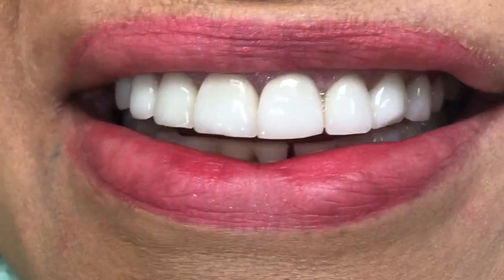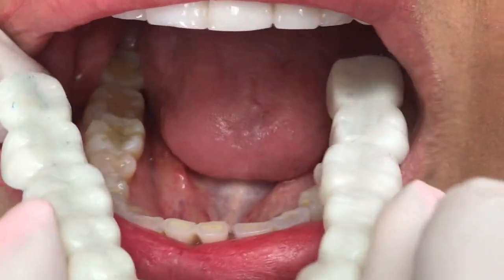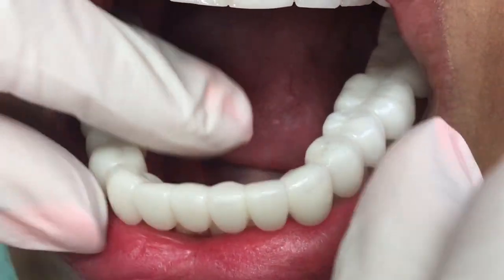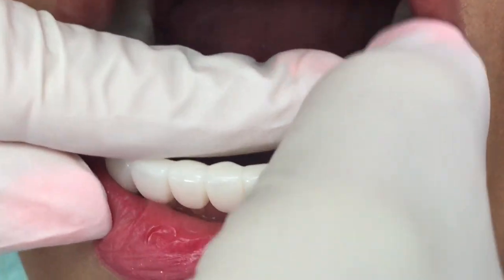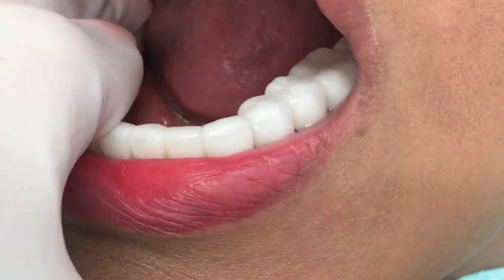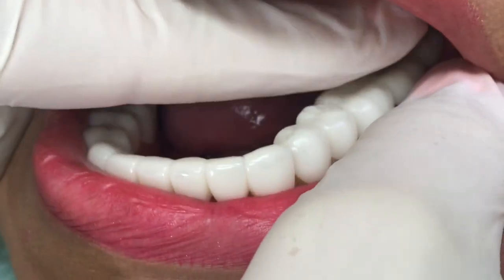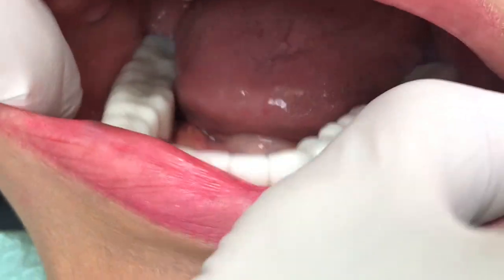All right, we're going to go ahead and place this in. So go ahead and open. Now she hasn't seen it. The appliance literally is held by retention. There's no glues, there's no adhesives, there's nothing. It literally snaps into place. You can hear that snap. My favorite part. Bite down. Let me get this off. Hang on just a second.